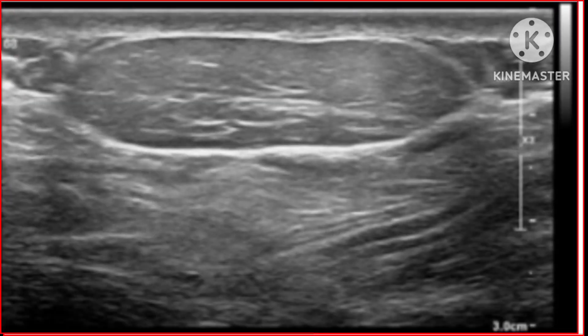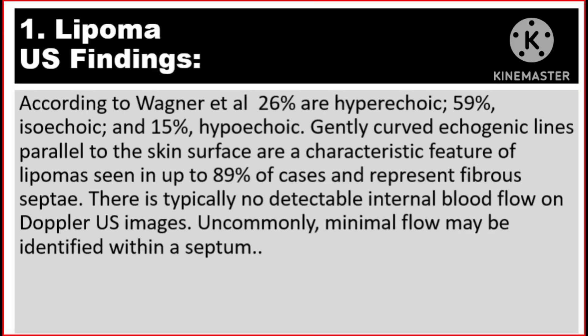Lipomas may be hyper-, iso-, or hypo-echoic when compared with adjacent subcutaneous tissues, with a uniform echotexture. Pure fat is anechoic, so echogenicity depends on the presence of connective tissue and other reflective interfaces in the lipoma. Additionally, lipomas tend to be compressible. According to Wagner et al., 26% are hyper-echoic, 59% iso-echoic, and 15% hypo-echoic. Gently curved echogenic lines parallel to the skin surface are a characteristic feature of lipomas, seen in up to 89% of cases, and represent fibrosity. There is typically no detectable internal blood flow on Doppler ultrasound images.